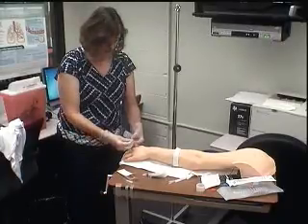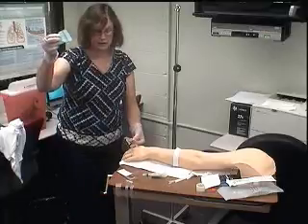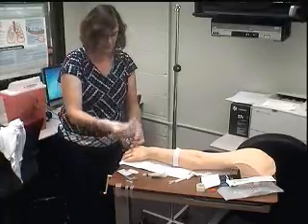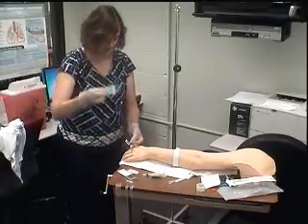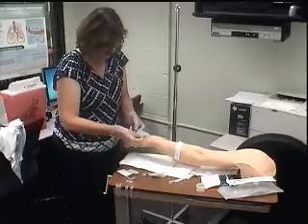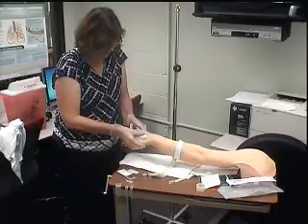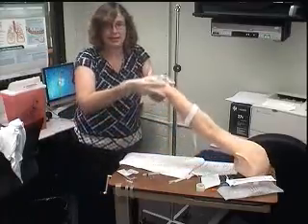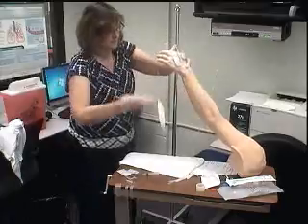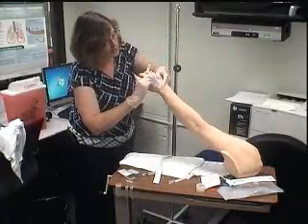So I'm going to take the back of this dressing off, and if I hold on to it, see how it stays stiff on me? Keep your fingers off the inside of that, because then I'm going to cover it about like this. I'll show you, I'll bring this over here. I'm going to cover all the pink part of it. So it looks like this right now. All right, so I've covered it up to about here where the pink is.